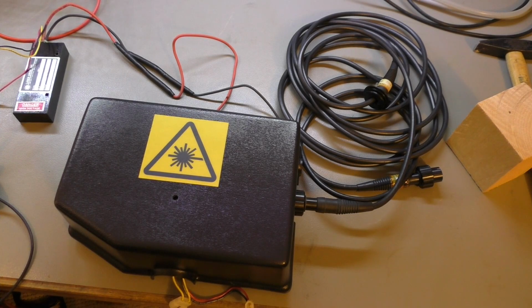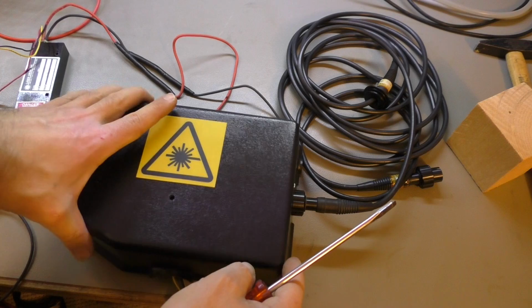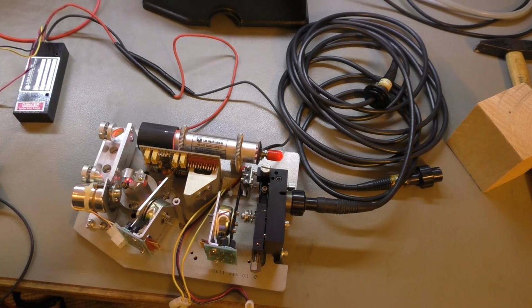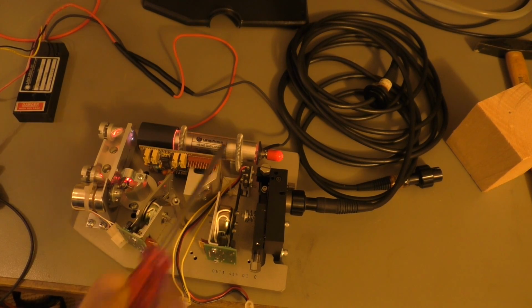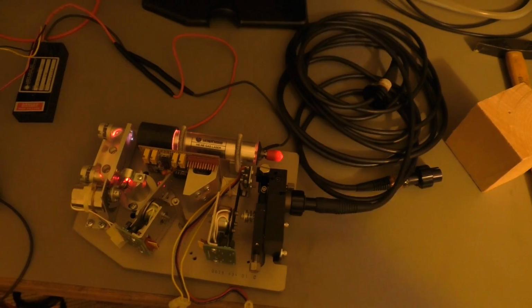Let's have another look at this black box, which comes from the same medical system. It's where all the laser beams were treated. Let's open that. I have already powered up the small helium neon laser here. You can see it's emitting light. Maybe I have to reduce my lights here.